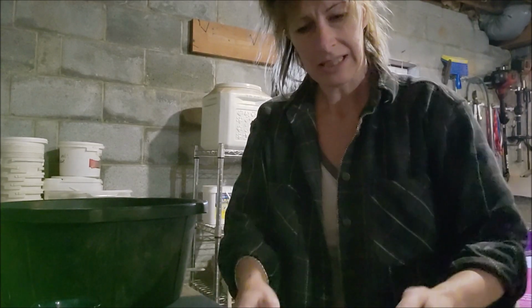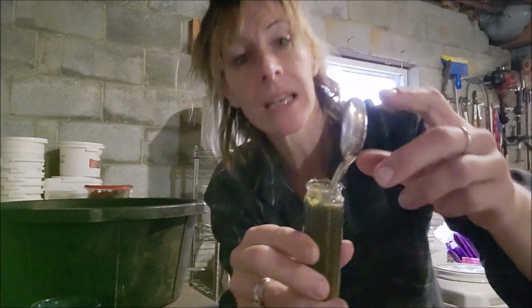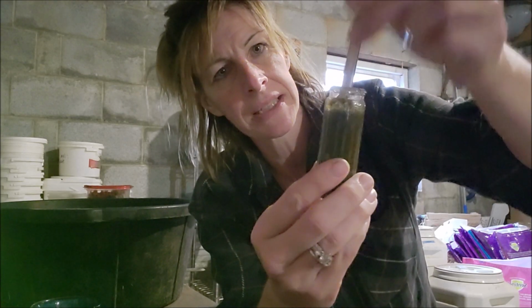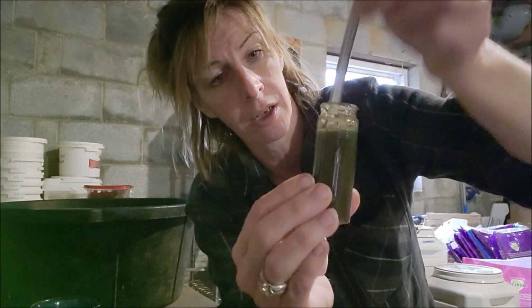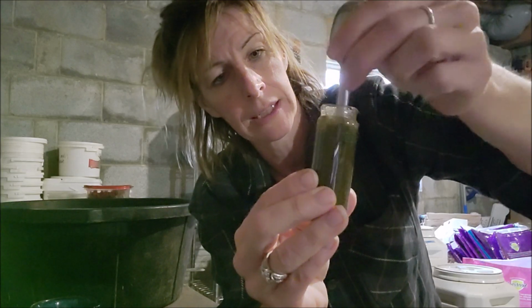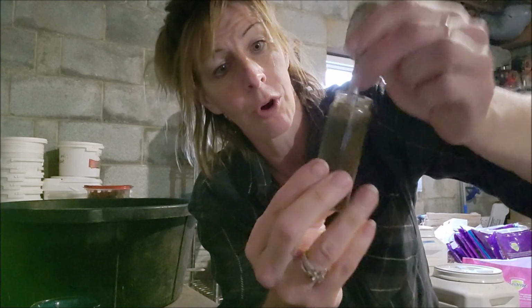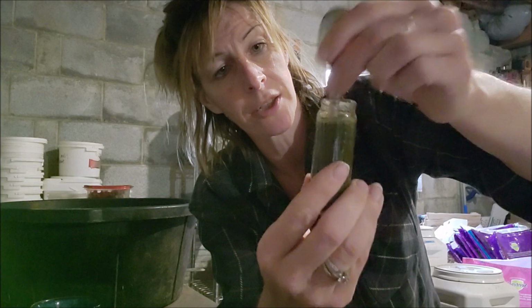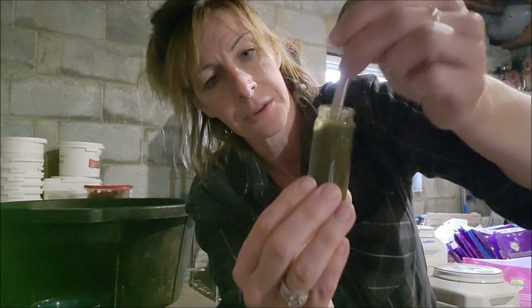So let's put the lid on that. Put that over there. Okay. So you're getting the solution and you're mixing it all up in the poop to release the eggs. So if he's got eggs of strongyles or tapeworm, well, same stuff as what you do with a dog. There's a whole bunch of stuff. So you want to mix it up really, really good. And you want to squash it. You want to really get them, because the eggs really stick to the poop. So you want to squash it all around.